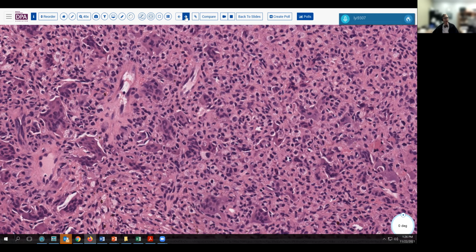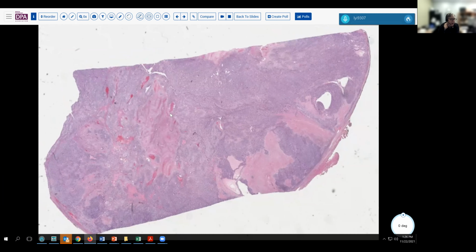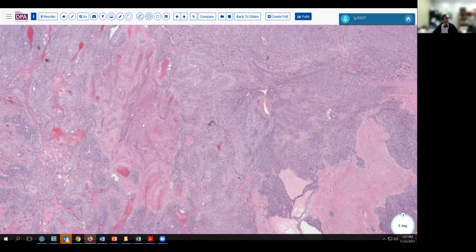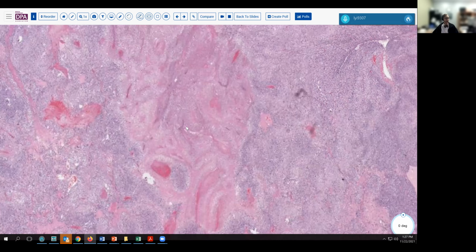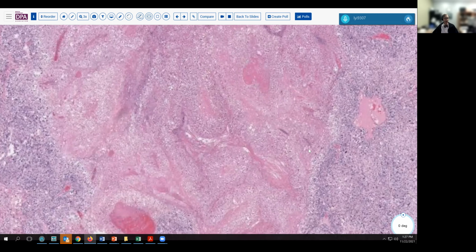So very quickly on to the next case that I'd like to present, which is a soft tissue lesion occurring in an early 30s age woman around the shoulder girdle. And here we see a rather blue tumor with geographic pink areas, sort of a map-like appearance, and some other more eosinophilic tissues here with maybe a bit of a vasculature type of background.